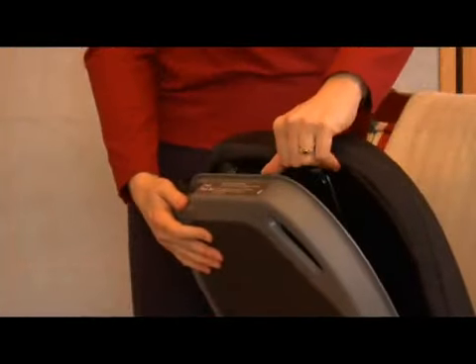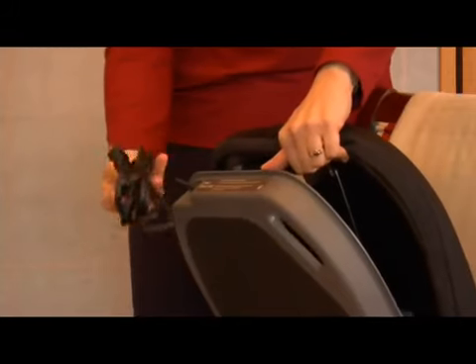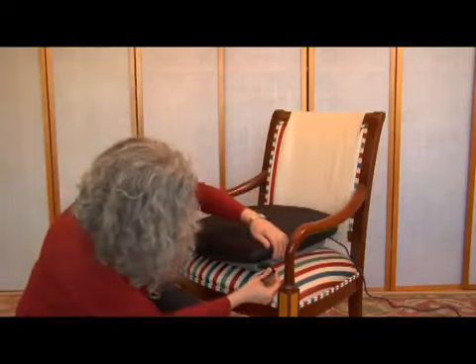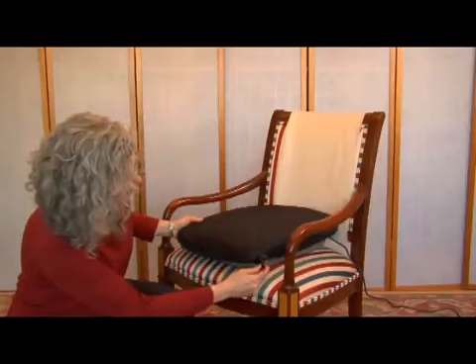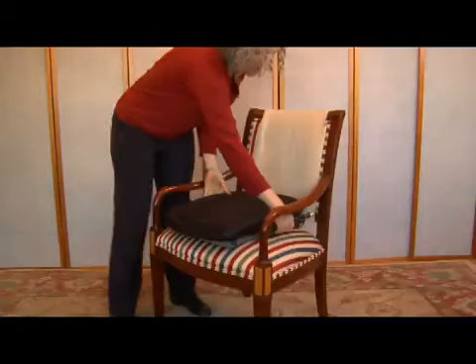Assembly is easy. You will find the power cord and user guide inside your new PowerSeat under the cushion. The PowerLever can be inserted on either the left or right side. To insert the lever, slide it into the plastic case like this — it will lock in place. To remove, pinch the lever and pull it out.